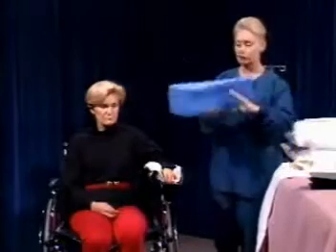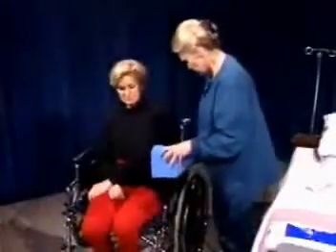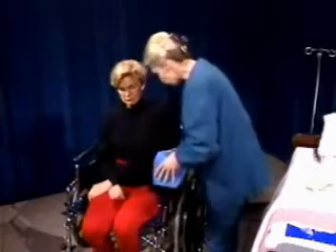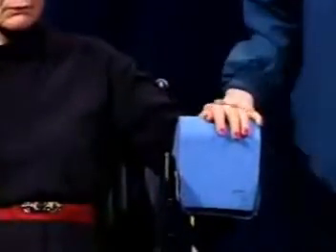So very frequently we add a foam rubber wedge. The flat, the back part of the wedge, goes against the back part of the trough. We'll demonstrate that. It just easily fits down, pushes into the trough rather snugly, and also gives some extra elbow cushioning that the towel does not always afford. And it keeps the patient's hand in a functional position that's perfect for the swelling to decrease and go back up into the body.